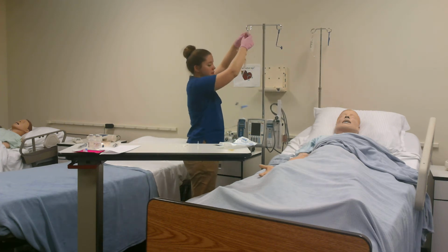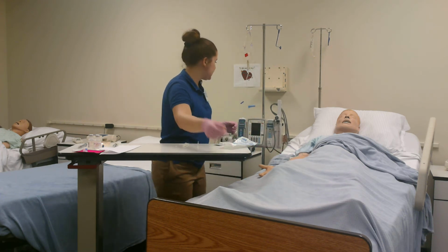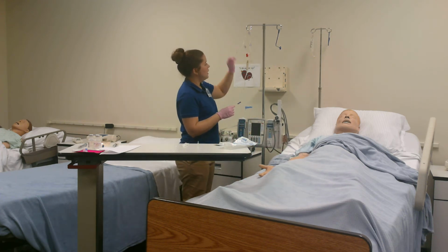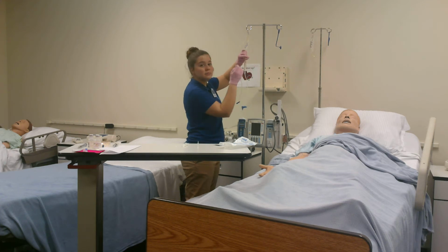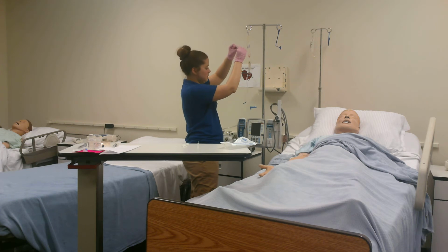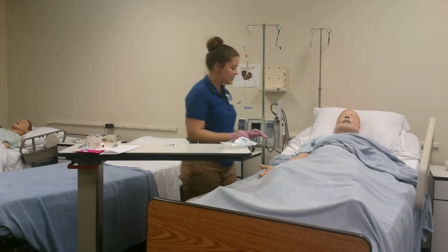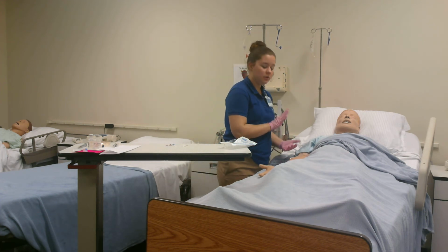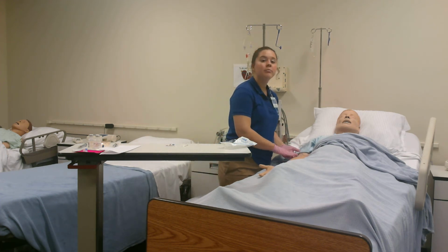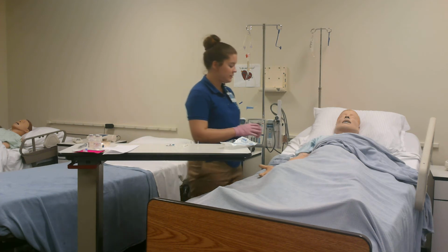Okay, there you go, Mr. Jackson. And I'm going to put my clamp on that. Excuse me. I'm going to put my alligator clamp on this, cleaning it with my alcohol swab. Okay, alligator clamp is in place. There we go. And now I'm going to, again, push 3 milliliters of saline into Mr. Jackson. I have my pre-filled saline syringe.